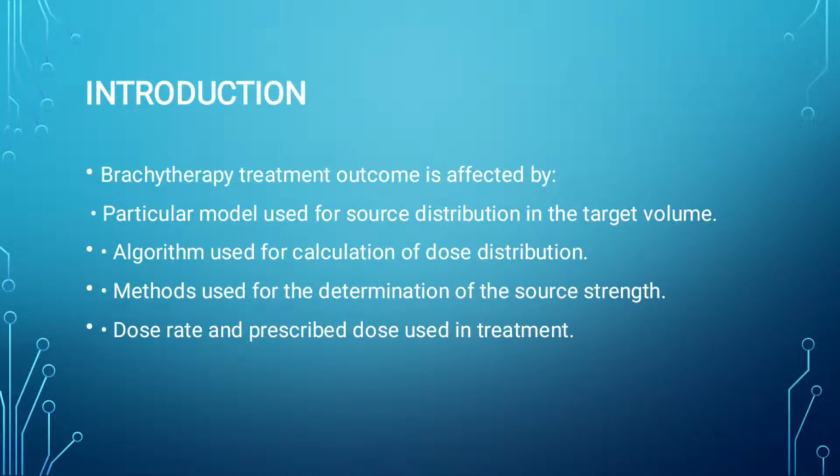Brachytherapy treatment outcome is affected by the particular model used for source distribution in the target volume, the algorithm used for calculation of dose distribution, the methods used for the determination of the source strength, dose rate and prescribed dose used in treatment.